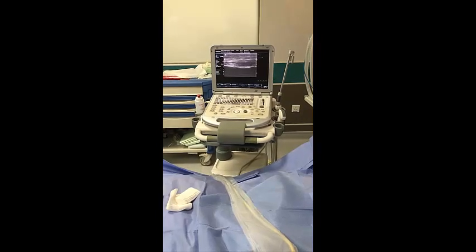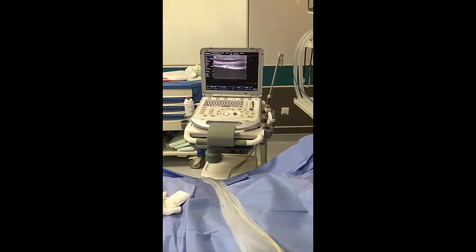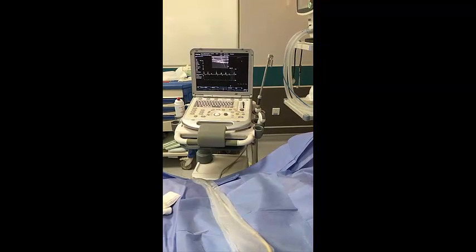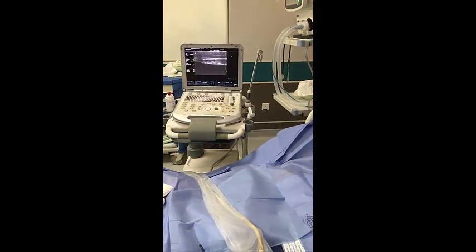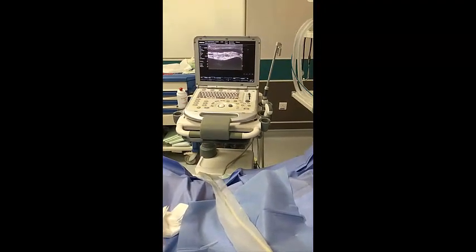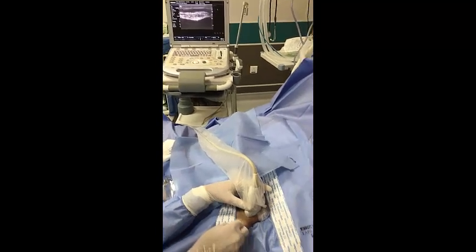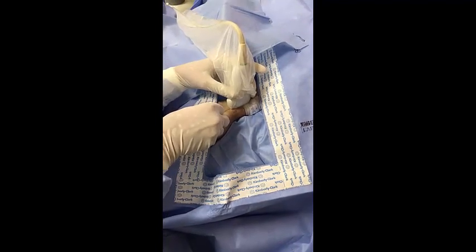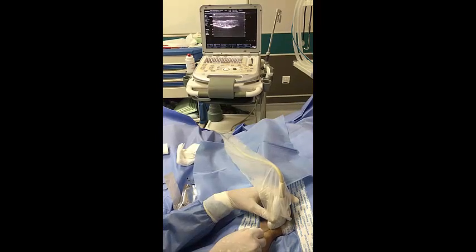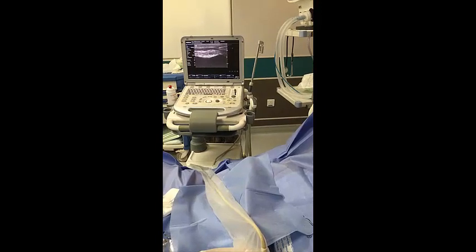This is the radial artery. I will now view it in longitudinal orientation in the proper way, and I can apply the pulsed wave system again. I should see the pulsation very clearly in the artery in a good longitudinal plane. Once I have a good longitudinal view, I need to be centered on the probe and go very superficially — the needle should be in the middle of the probe.